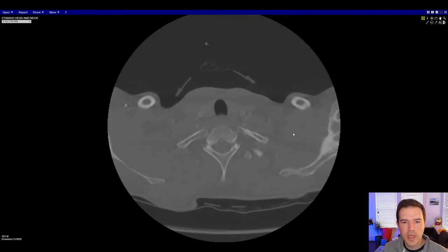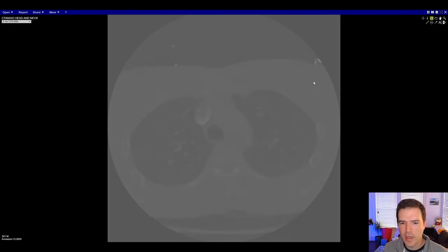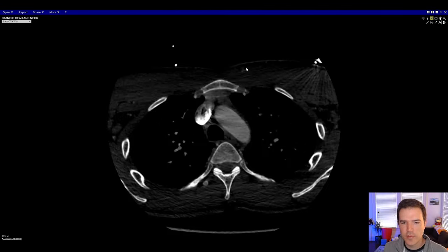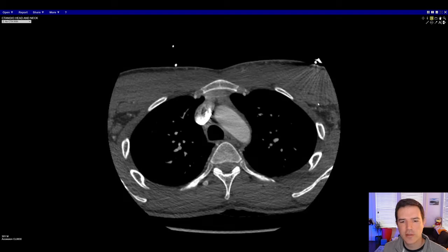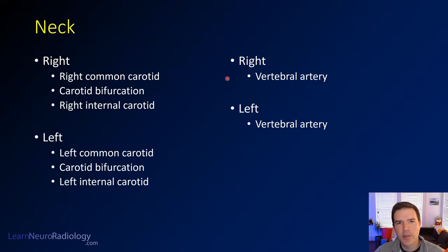Once we're happy with all of that, we're going to come back down to the origins of the vessels, window back out for vascular structures, and then start our vascular search. When we start with the neck, we're going to make four passes: first look at the right anterior structures — the common carotid and internal carotid — then the left anterior structures, then the right vertebral artery, and then the left vertebral artery. We'll make four passes through the neck starting from the bottom.